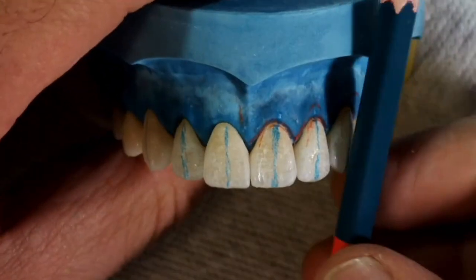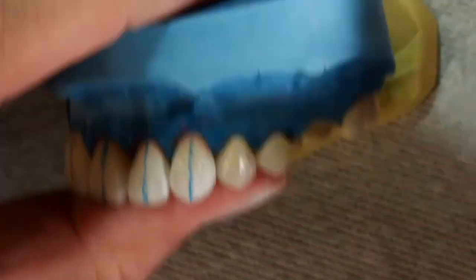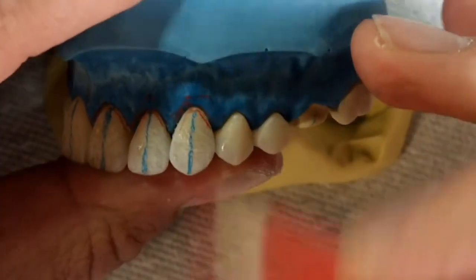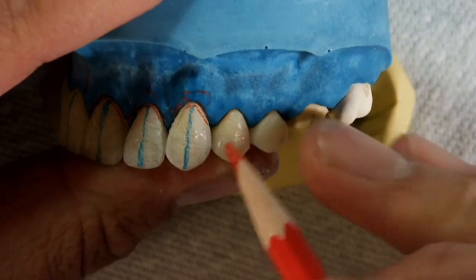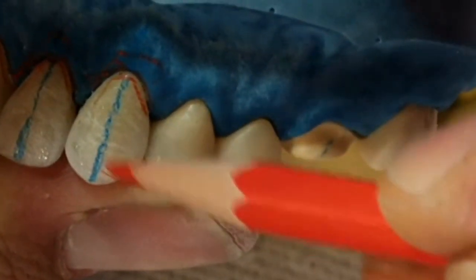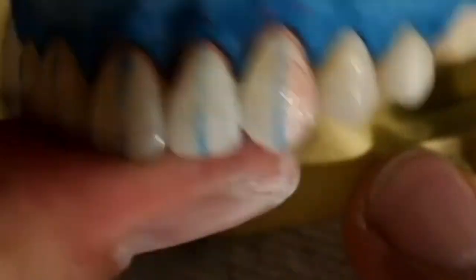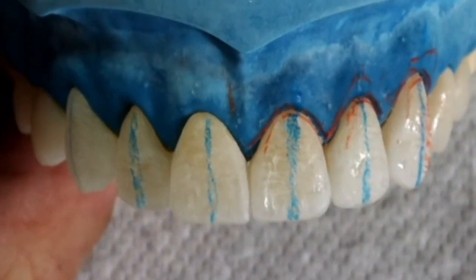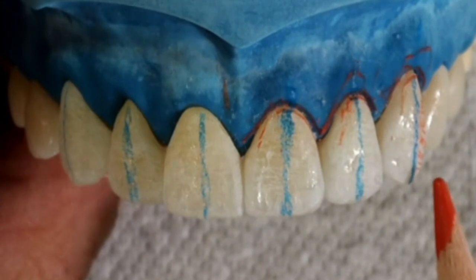When we look at the canine from a frontal view, it appears that the long axis is tilted heavily mesially — this is called mesial inclination. When we shift our view directly onto the canine, we notice that it is rather straight. This optical illusion results from the fact that the area distally of the long axis is usually not visible.